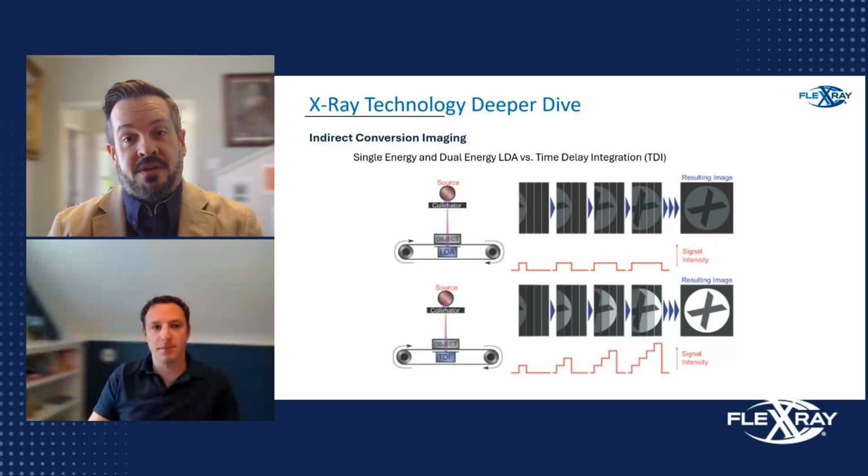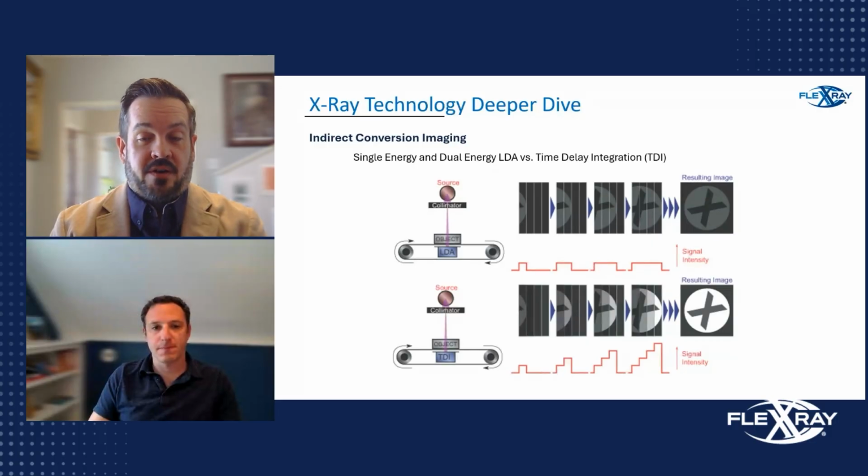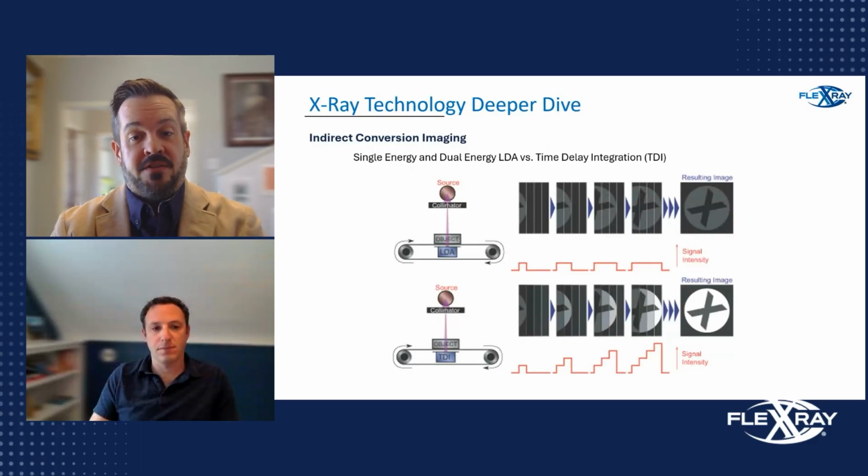But for just a moment, the way an inline instrument works from an X-ray perspective is the image processing that's represented at the top of this visual. The strips of diodes across the conveyor are taking the image as it passes the product and creating an image and averaging the data from each one of those diode strips to create a composite image and ensure good detection rejection.